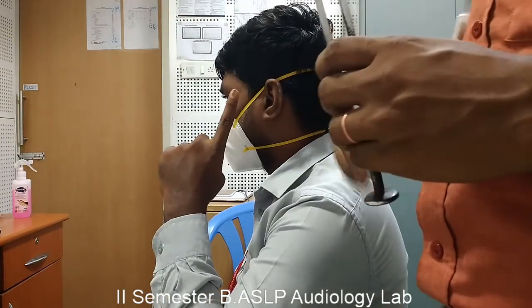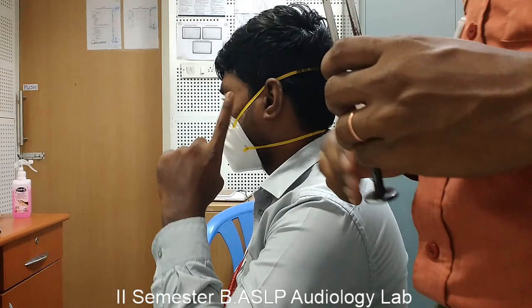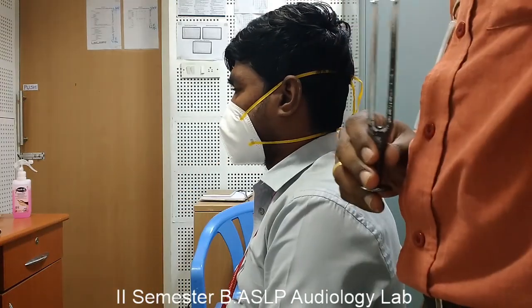Here the subject says the sound was perceived louder in front of the ear canal rather than at the mastoid process. So air conduction is louder than bone conduction, which indicates Rinne is positive. The interpretation is that the subject has either normal hearing or sensorineural hearing loss.